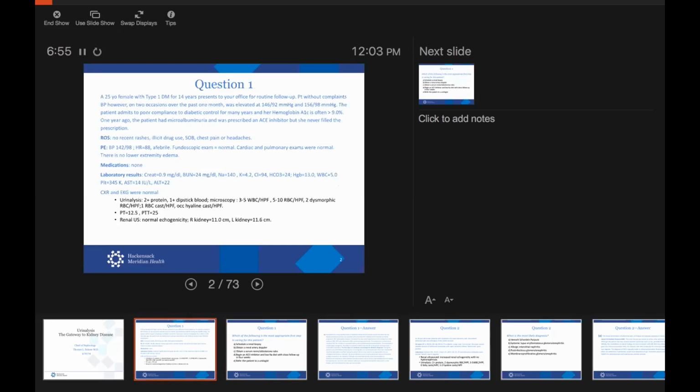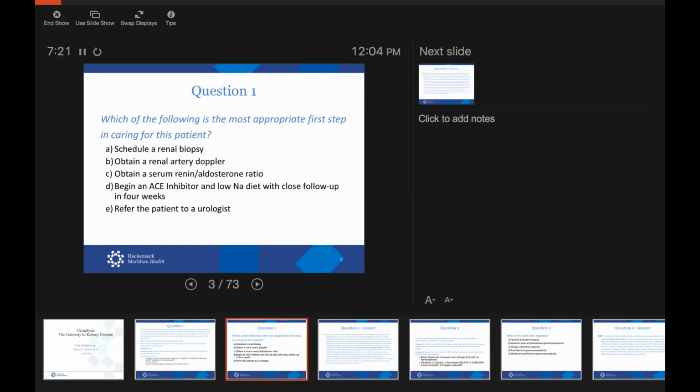So I'm going to come out and say very strongly that this means the urinalysis lab is not good, plain and simple, because that means you've never seen glomerulonephritis. There are no hospitals that have never seen glomerulonephritis. I can tell you in the best hospitals in the world, we used to see red cell casts reported all the time, okay? A red blood cell cast is a renal emergency. That's the point of this slide, okay? This patient should have a renal biopsy. And if you miss it, you're going to cause this lady to go on dialysis.